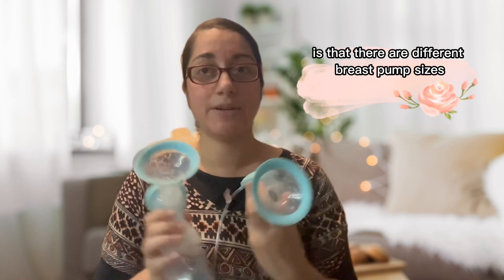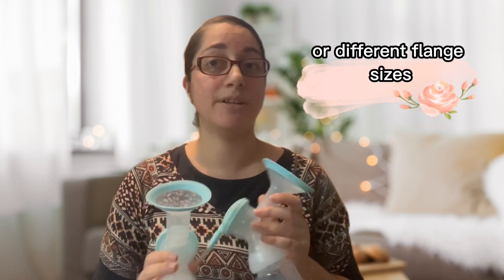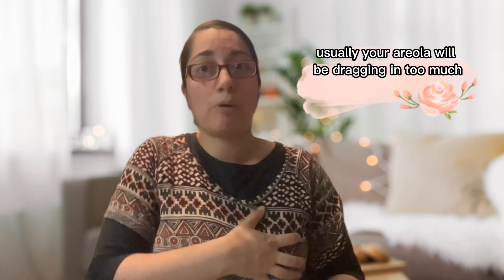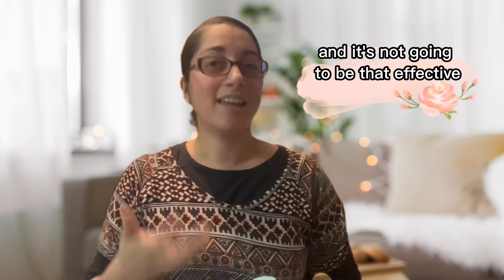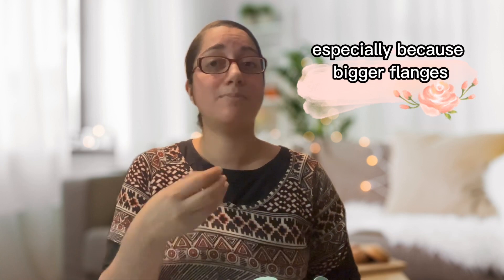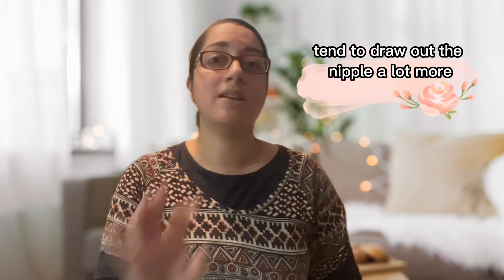One thing that's very important to notice is that there are different breast pump sizes, or different flange sizes. If you use a size that's too big, usually your areola will be dragging in too much and it's not going to be that effective. It can even cause nipple damage, especially because bigger flanges tend to draw out the nipple a lot more.